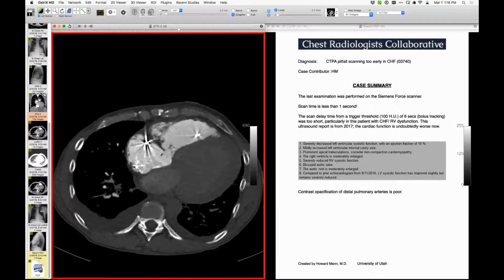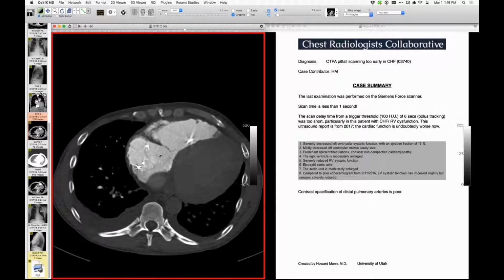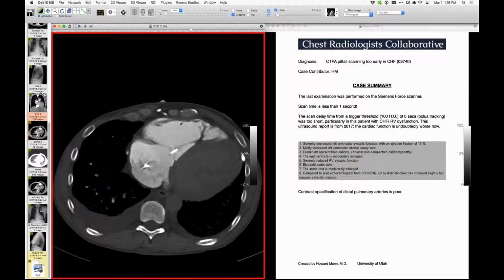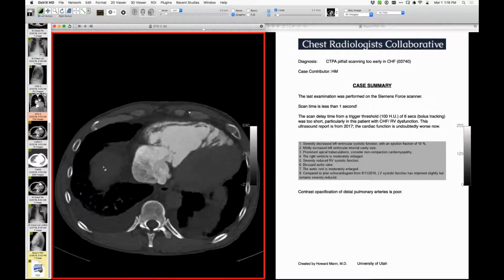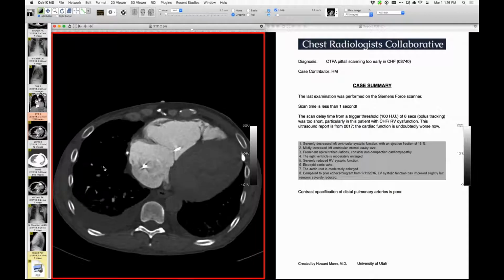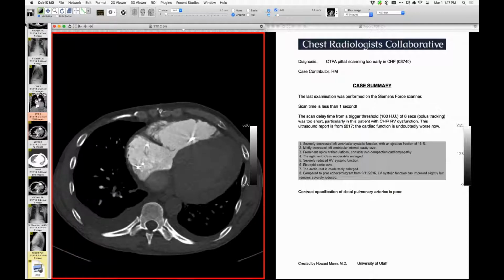Yeah. So another thing I've learned with this new scanner we have, which is the dual source, is that there is something called a pitch-dependent scan field of view. So sometimes if you want to really get the fast turbo flash, you can't necessarily scan and include the entire patient. In other words, the scan field of view is less. It's not a problem for the heart only because the scan field of view is small for the heart. But if you're scanning a big patient, you may not be able to get that speed and scan the whole patient. So it's sort of a pitch-dependent scan field of view. But even without what's called the turbo flash, yes, it's really fast. This is only about half a second, between half a second and a second. Yeah.